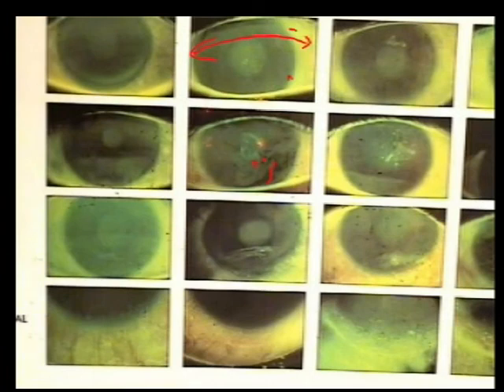And if we take fluorescein, which is a vegetable dye, and we instill it into the tears, it mixes readily, and under a cobalt light, it will take the yellowish orange fluid and turn it a fluorescent green. If you look at the upper right-hand slide, you can see it's a fairly uniform tear layer. You know, they just blinked and it's looking pretty good.